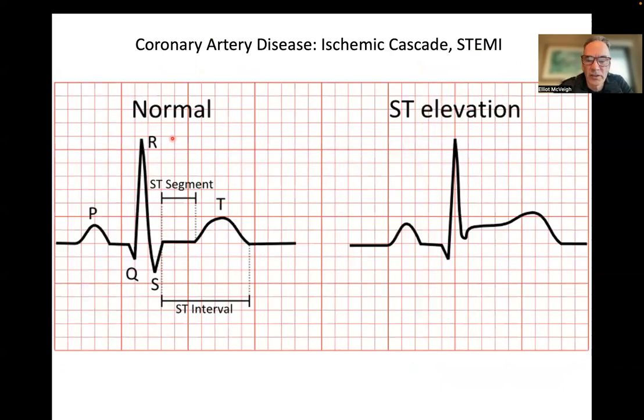When a physician is looking at these, not the size of it, the relative polarity of different leads on a 12 lead EKG is important. But for our case, what we're really looking at in coronary artery disease is, can we detect when there's a large chunk of myocardium that is ischemic, right, and is not depolarizing properly.